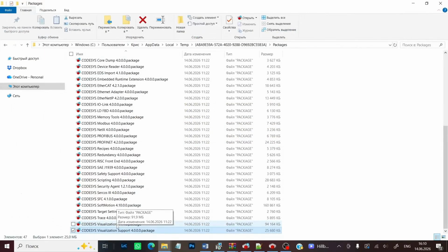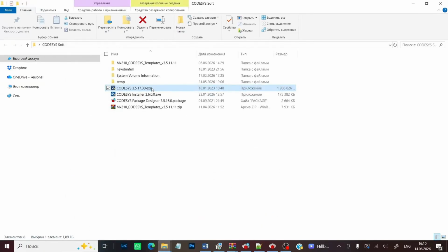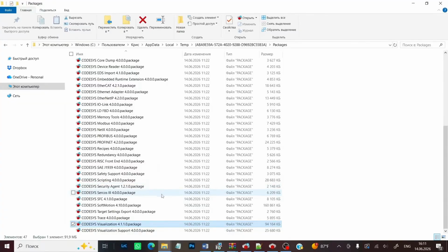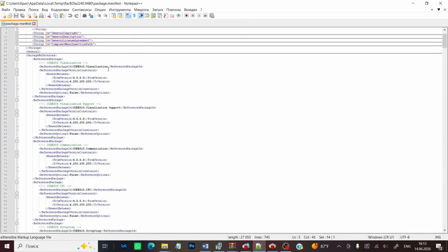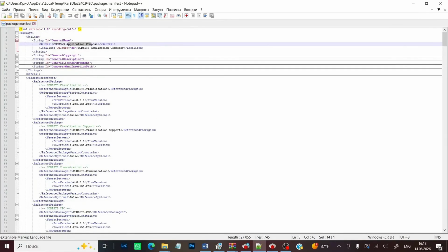This library is just one of many libraries that are part of the visualization package, which in turn is one of many packages included in the CODESYS IDE installation file. And when you install the IDE with all the default settings, your computer gets the full set of packages included in the installation file. And in the CODESYS installer, you won't be able to update the visualization package version because the application composer package depends on it. Accordingly, you won't be able to update any of these components until you remove the composer package.